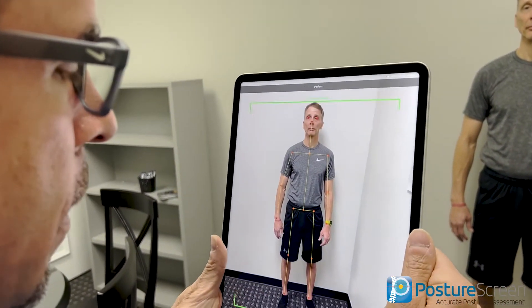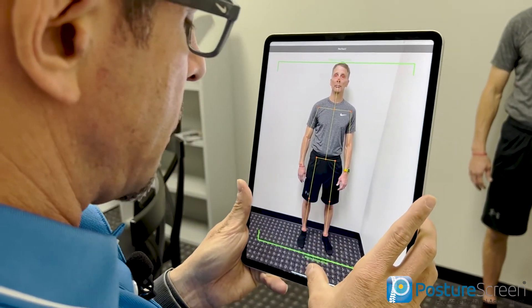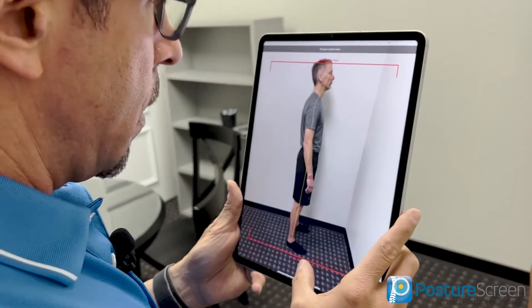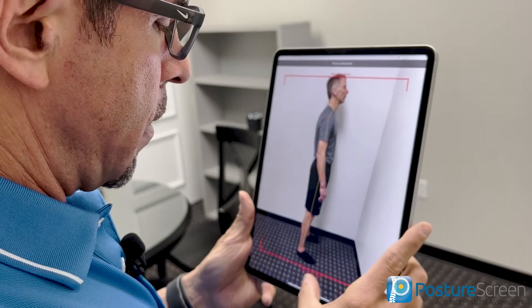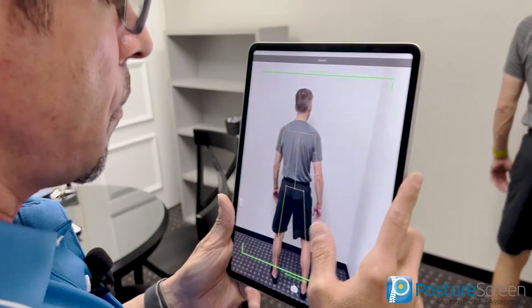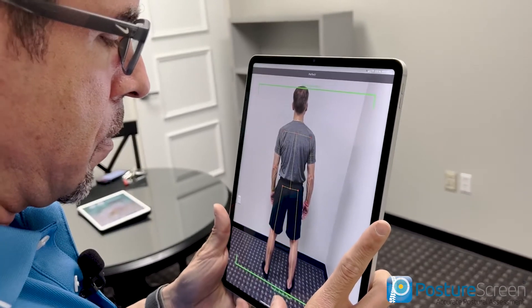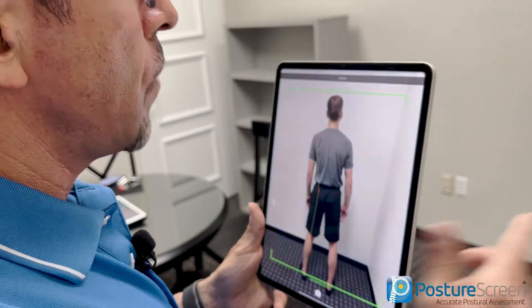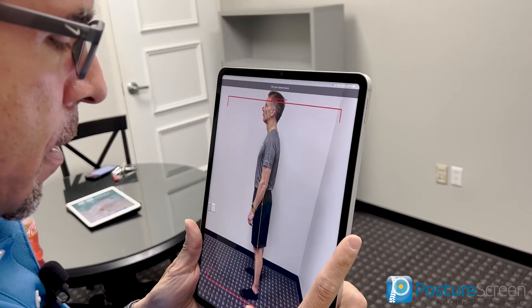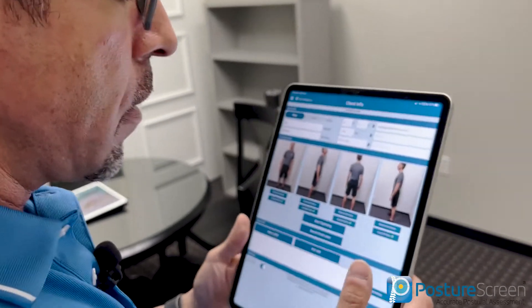Let's go ahead and start. I'll click the first capture and bring it up to him, making sure the frame is balanced as best as possible. I ask the client to turn to the side, then capture again, then another quarter turn for the posterior view — making sure to mark that correctly — then another quarter turn for the final lateral. Always keep an eye on the background as well.